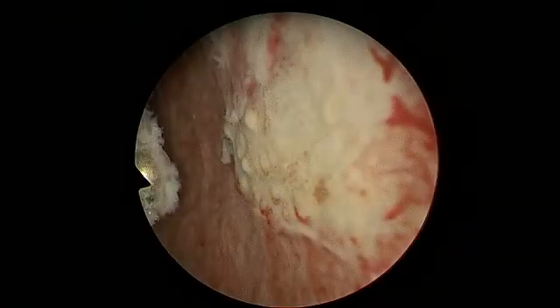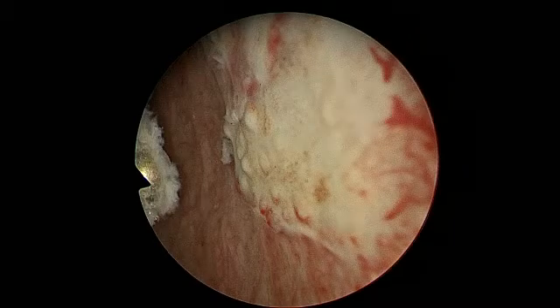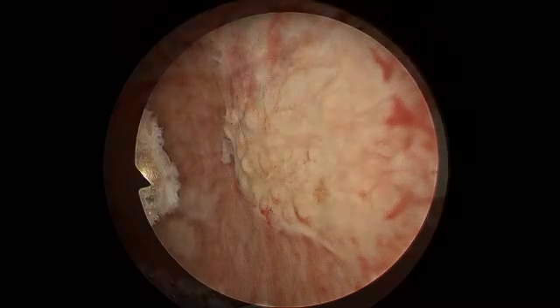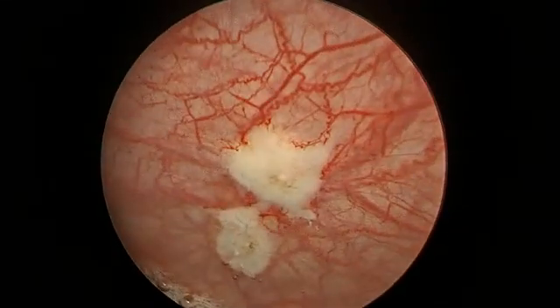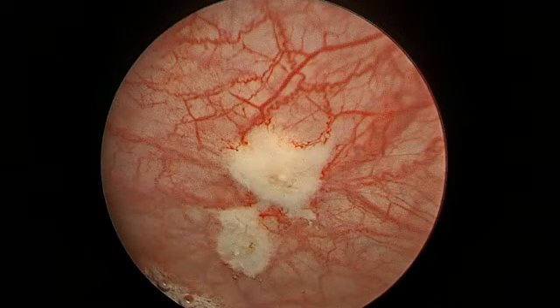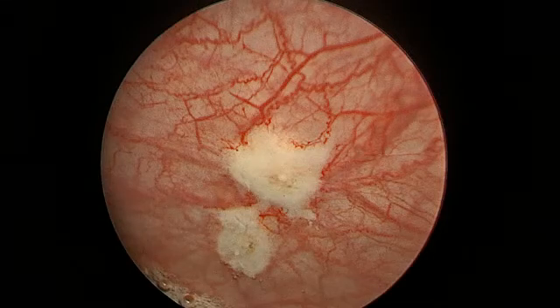During fulguration with a Bugby electrode on a low setting of 20 or even 25, they blanch out but do not shrink or go away. In several instances, it is clear that they are deeply rooted and have spread out underneath the urothelial surface, confirming they are well embedded in the tissues.